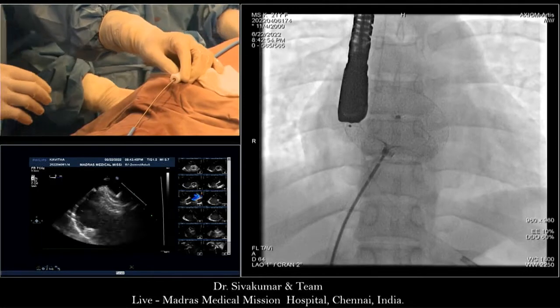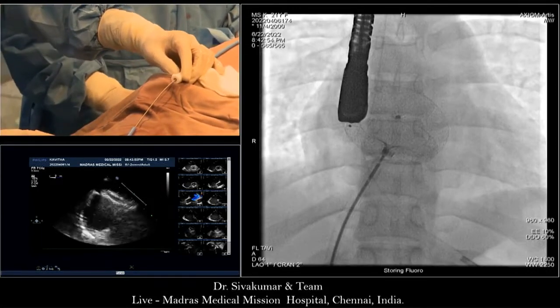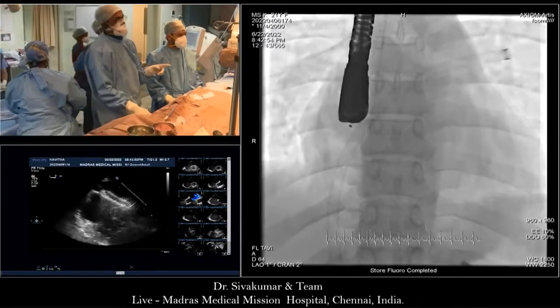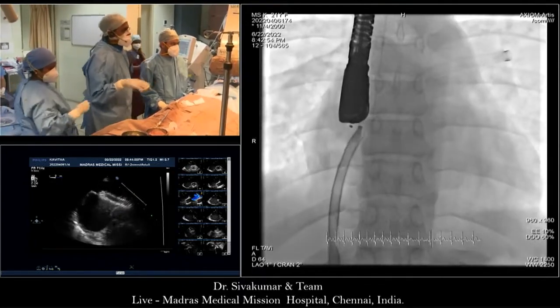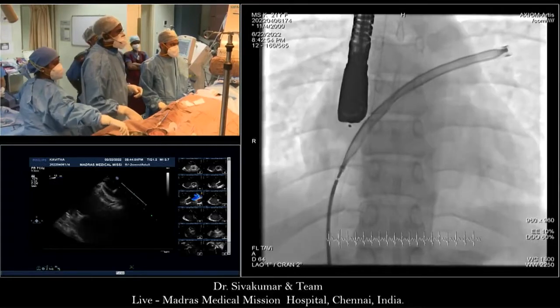Okay, but it looks... So what did you do? Pull your left hand or push your right hand? In the previous deployment I pushed my right hand, but in this particular one I did not pull anything. But it looks very undersized to me, like it's very unstable looking.